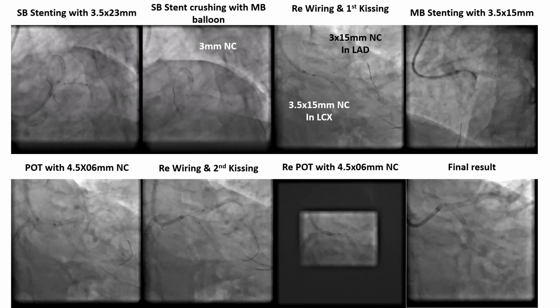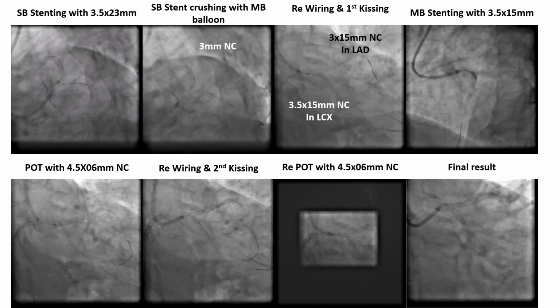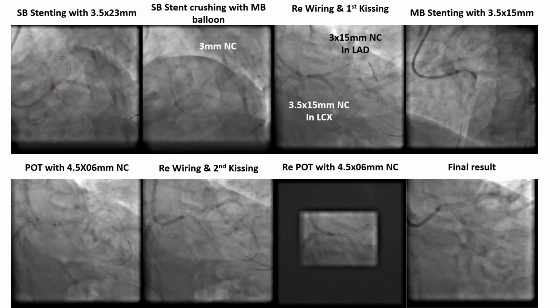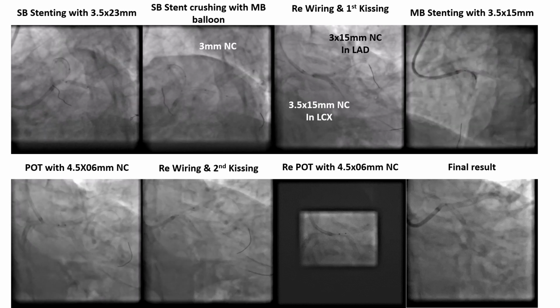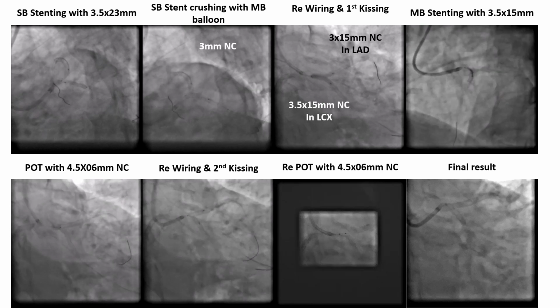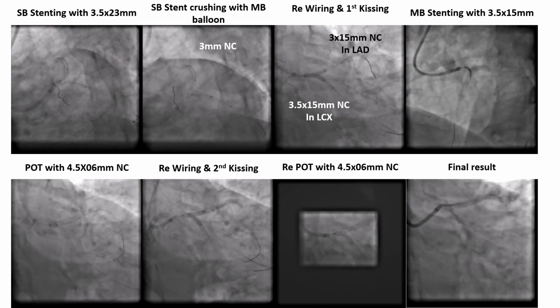So a left main DK crush we did with plaque modification, and see, bleeding is less; if it were femoral, and a 75-year-old with obesity is there. In the MATRIX study, if you see, the maximum complication rate is due to the access complications. So that's the reason MACE rate is much more in femoral versus radial.